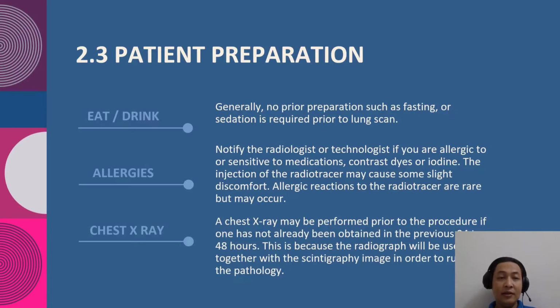For allergies, notify the radiologist or technologist if you are allergic or sensitive to medications, contrast dyes, or iodine. The injection of the radiotracer may cause some slight discomfort. Allergic reactions to the radiotracer are rare but may occur.